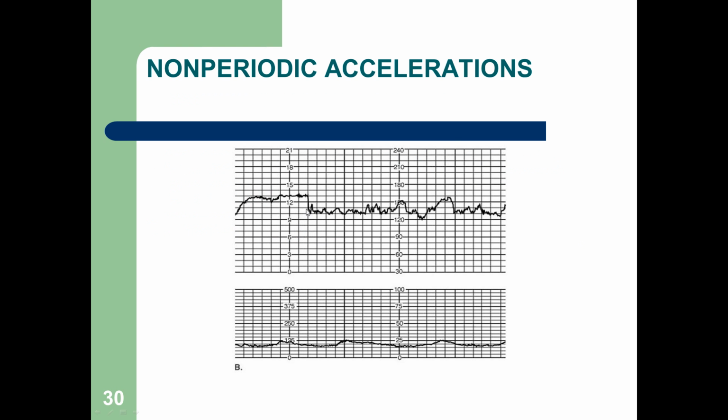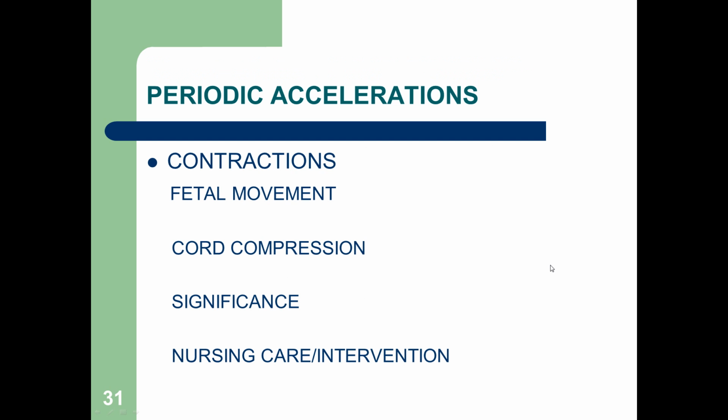Okay, here are some non-periodic accelerations. You can see some accelerations in the fetal heart rate, and they're not significant or associated necessarily with the contractions, okay? These are contractions down here, fetal heart rate up here.